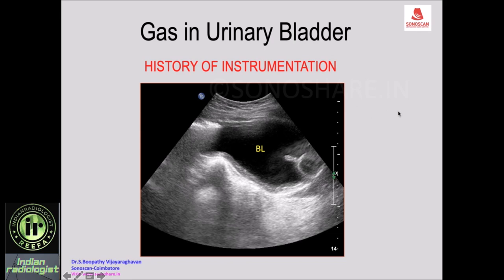Once you see gas in the urinary bladder, before proceeding to look for the cause, you must ask for a history of instrumentation. You may see a Foley bulb as proof of instrumentation. If a catheter has been removed, you need to elicit that history from the patient, which would indicate that the gas is due to instrumentation.